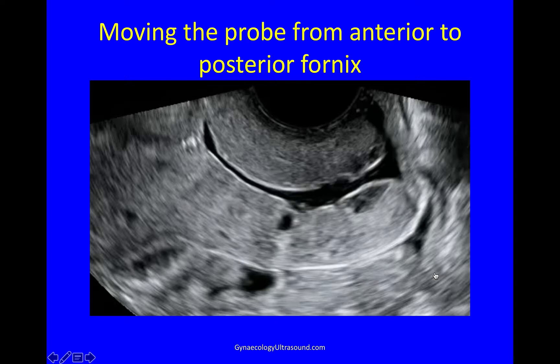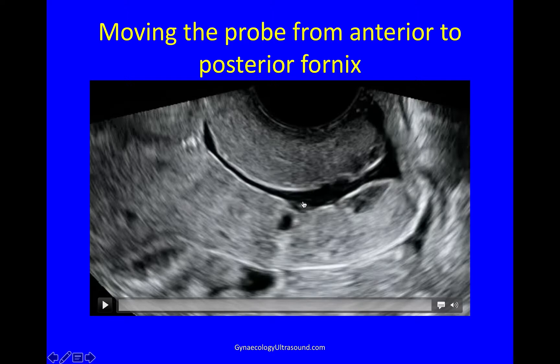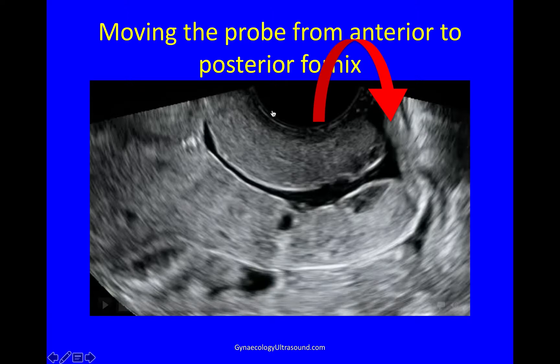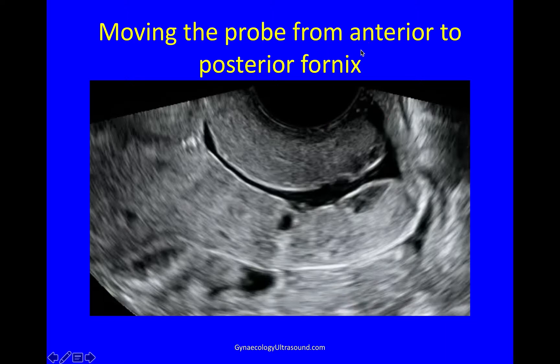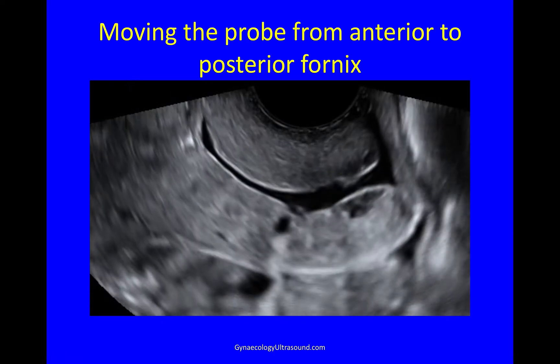This is how we do it in the longitudinal view. This is the cervix — you can see the external os, the cervical canal, the internal os. There's a little bit of dark, which is just some mucus. You can see the posterior vaginal wall and then the posterior vaginal fornix. The probe is in the anterior fornix because I can see the cervix. What I need to do is move it from the anterior fornix into the posterior fornix by very gently withdrawing the probe a little bit, angling it more in a posterior direction, and gently inserting it.